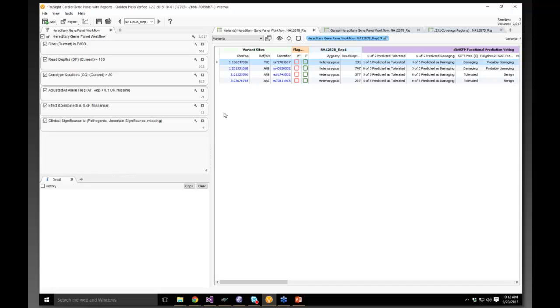This is their dashboard. And you can see right away we have at the top the current sample that we're selecting, and this is a filter chain describing the filters that were defined, the thresholds and the annotations defined during the R&D phase of the test, and now it's in production. We're filtering down to 4 variants.